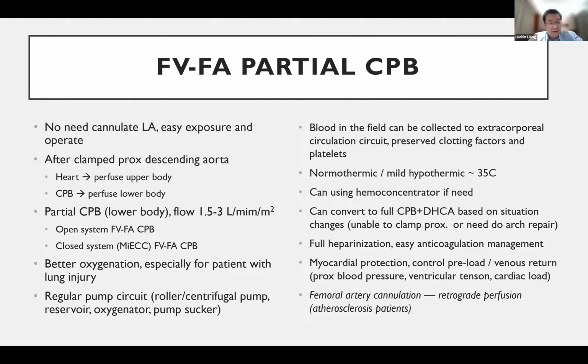Because there's an oxygenator involved, you get better oxygenation, especially for patients with lung injury. We can use a regular pump circuit. You can use a roller pump or centrifugal pump. You can still use a hard shell reservoir. There's an oxygenator, and you can use a pump sucker. So this is like using a regular pump circuit.